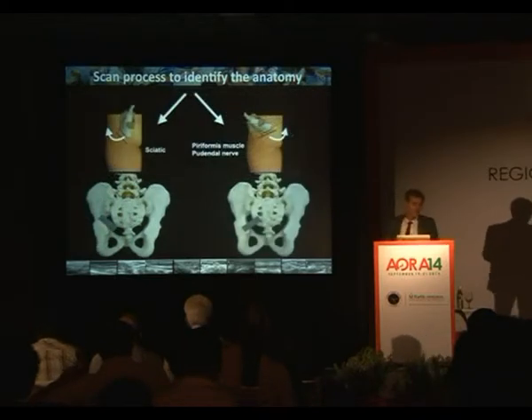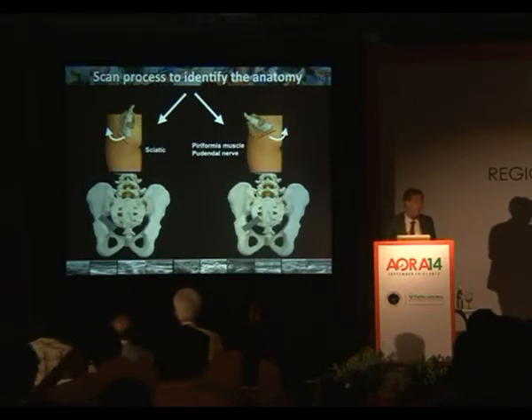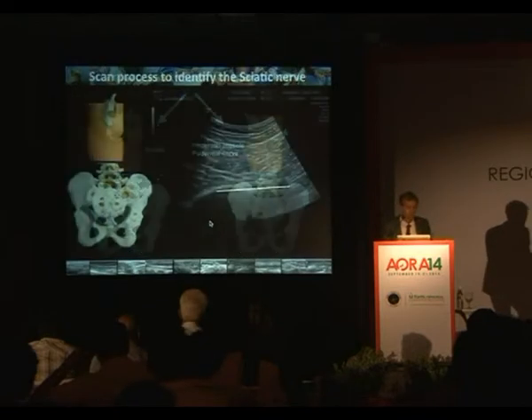So at this moment, I have two choices. I can perform a piriformis injection if I'm doing some pain procedure, I can do a pudendal nerve block, or I can do a sciatic nerve block. I'm going to describe the sciatic nerve block, so I'm going to turn my probe laterally. How do I turn my probe laterally? 5, 10, 15 degrees? I don't know.